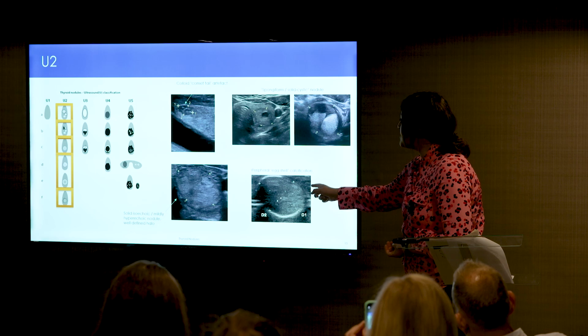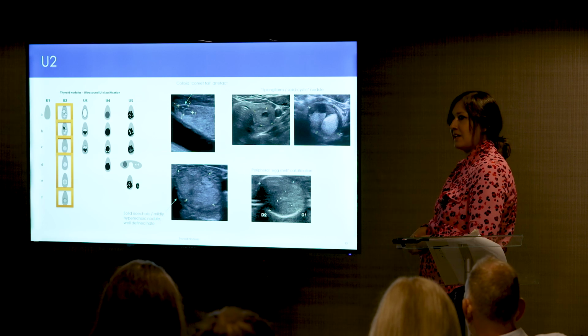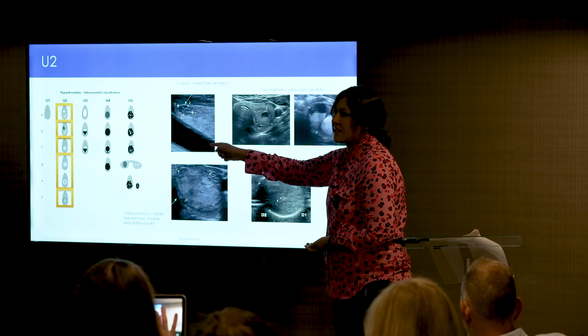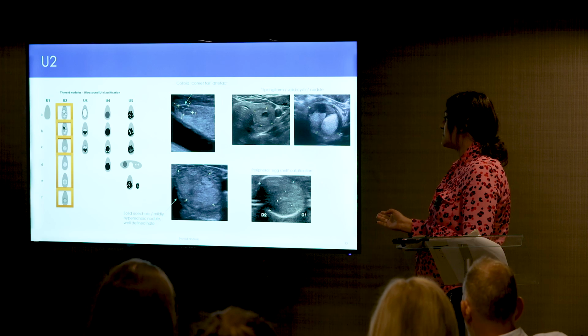This causes a lot of debate amongst radiologists actually, but this is a nodule that demonstrates peripheral eggshell calcification. As you can see, this is also present in the U4 category, and therefore it's something that can cause a bit of debate whether classifying it as U2 or U4.